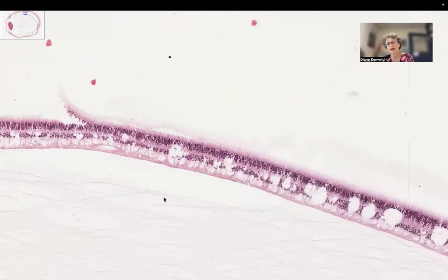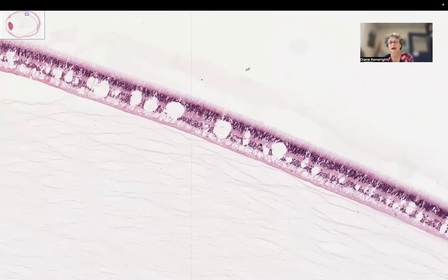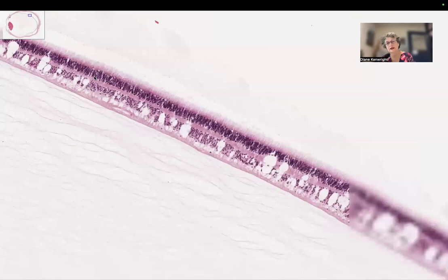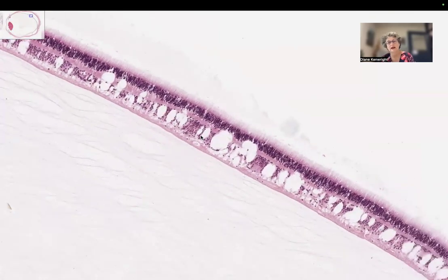Continuing posteriorly, and we're coming towards the macula now, you can see that the outer and inner nuclear layers are thickening up, but still no ganglion cells. I'm looking quite hard to see if there is any evidence of soft and hard exudates, but I haven't seen any. There's just all this edema.